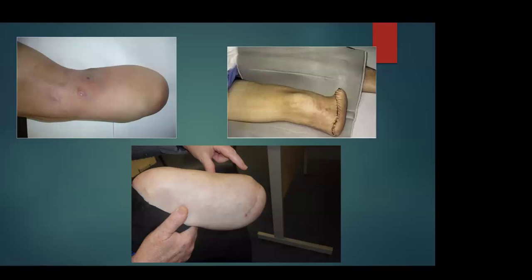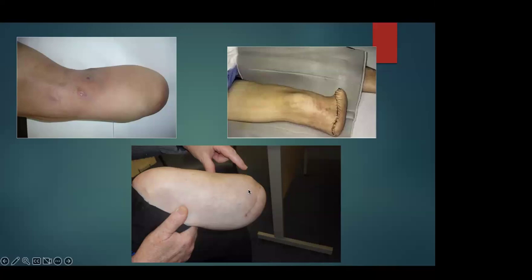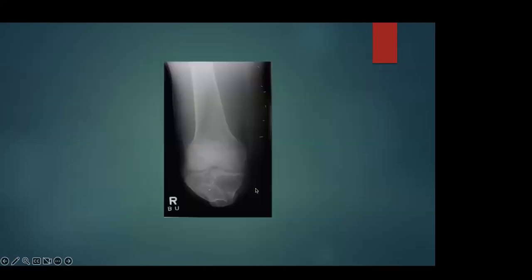يعني هو يخيط في البريوستيوم؟ لا، هو يخيط في العظم. العظم نفسه. Okay. ليه البريوستيوم بيفيل. This is more failure of myoplasty, and this is extremely painful. العيان ده مش عاوز يمشي لحد دلوقتي because of this, and it was sent for a revision.